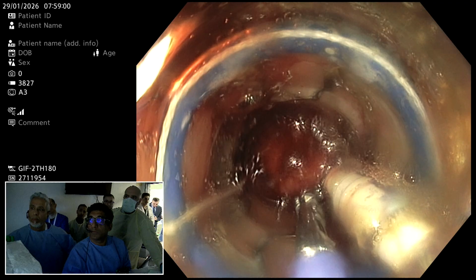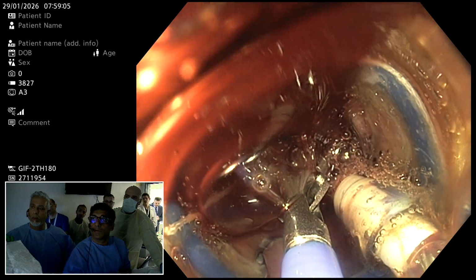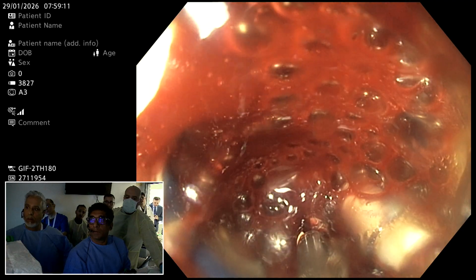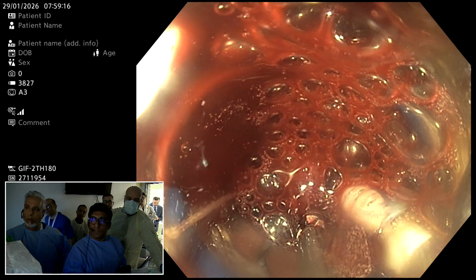Close, half close, please. Open. Close. It's quite a hard tumor, and okay, open.